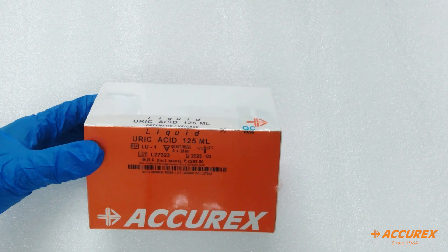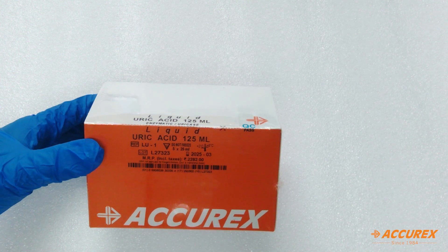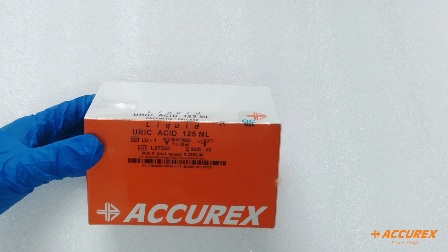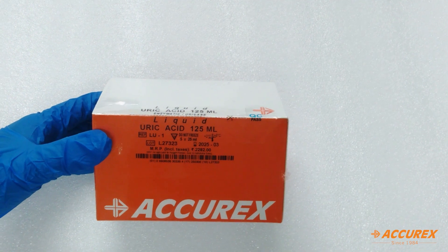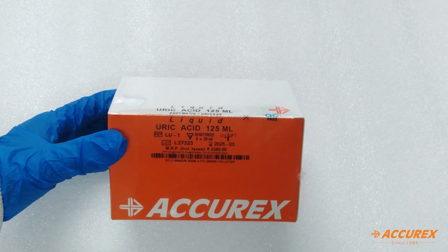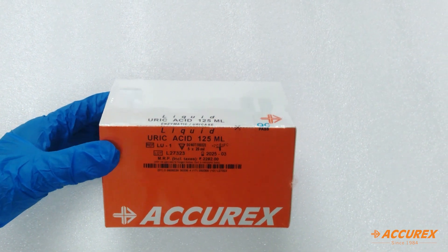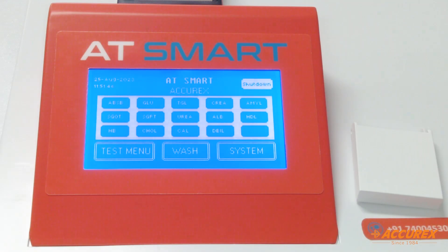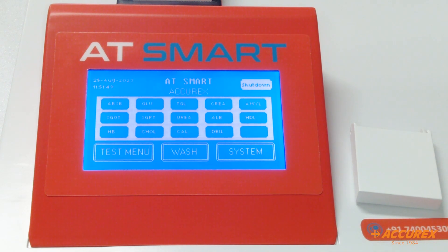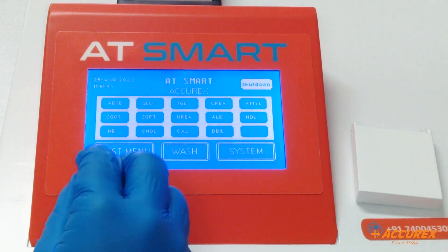Hello everyone, welcome to Acurex YouTube channel. Today we will see how to program uric acid on a semi-automated analyzer. For the programming part, we are taking the AT smart analyzer.